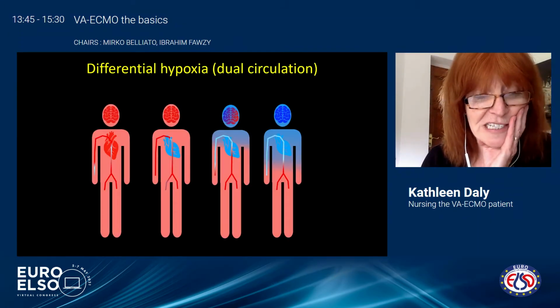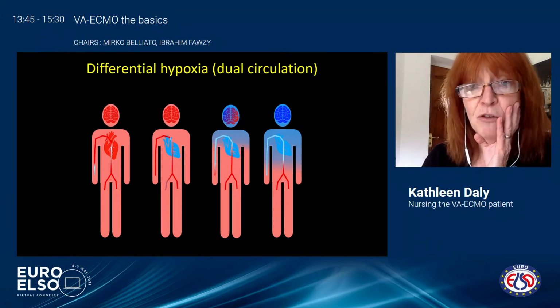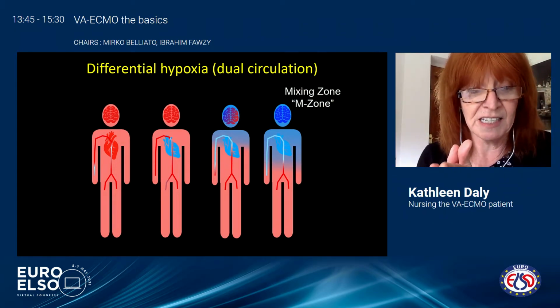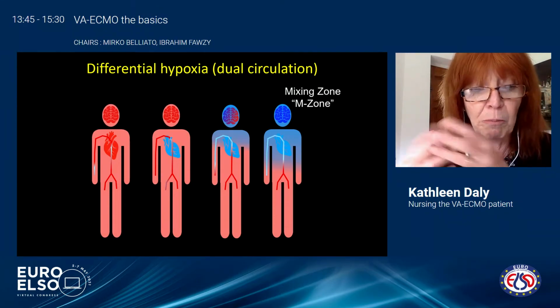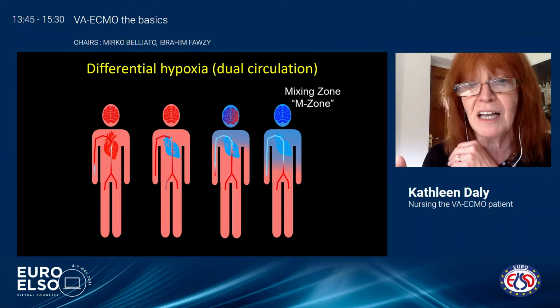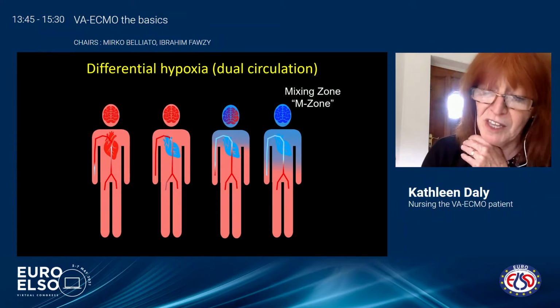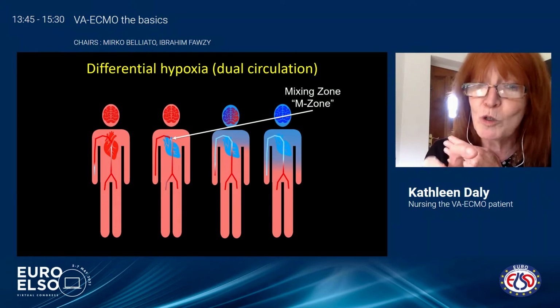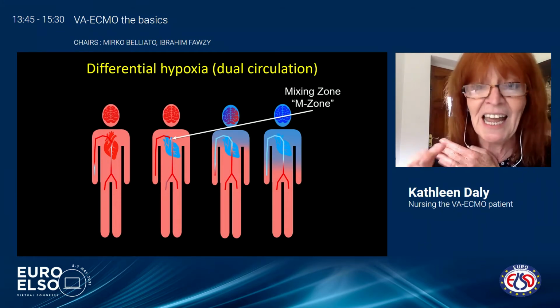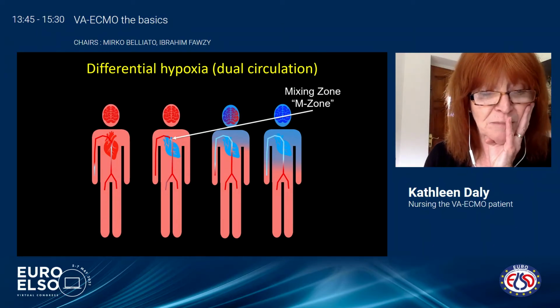And we see this, obviously, in peripheral VA ECMO, and it's caused by recovery of the heart in the presence of diseased lungs. So the lungs are poorly perfused. There's either pneumonia or pulmonary edema or some other underlying etiology. Well, when the heart is not ejecting, this initially doesn't cause too much problem because the ECMO blood flow can continue oxygenation around the body.